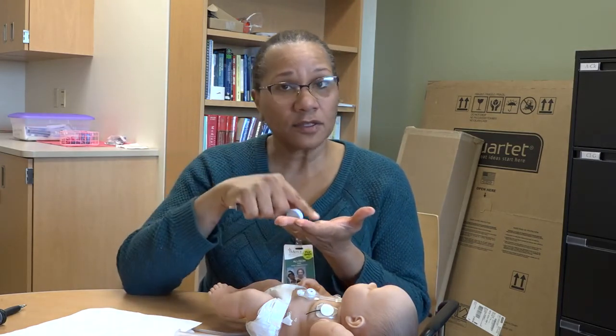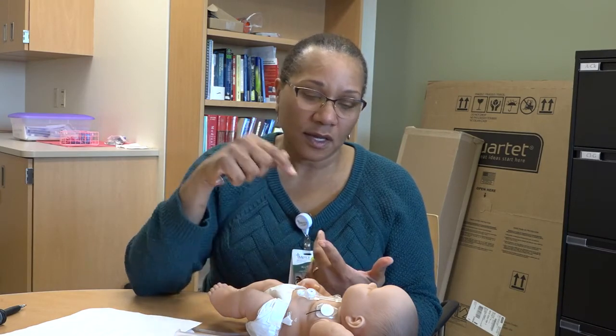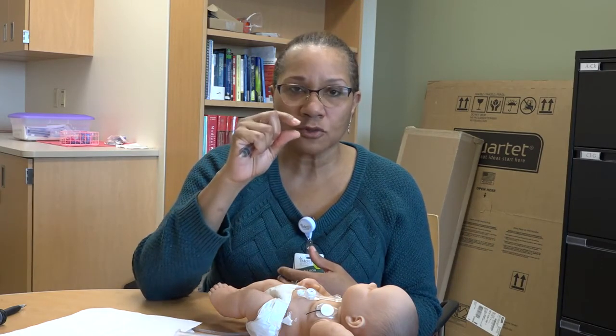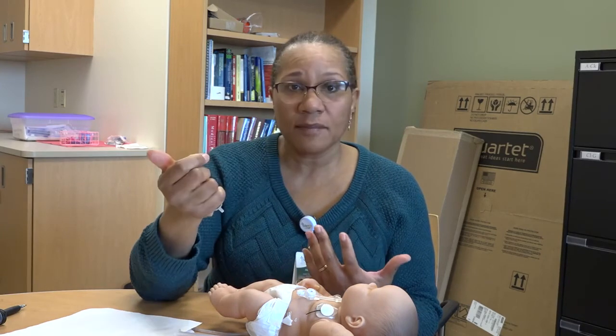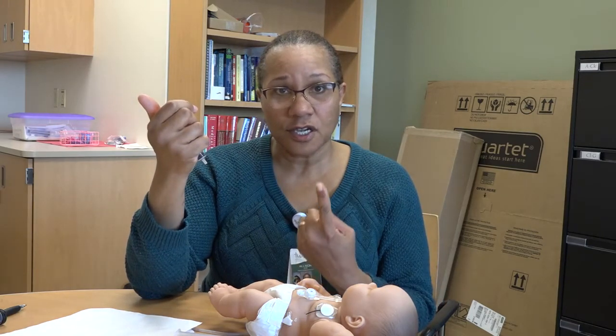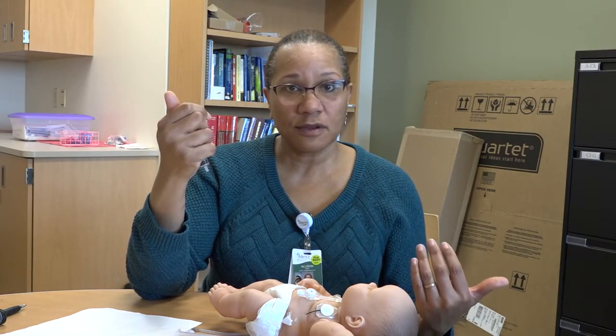So the other thing about medications is, let's say it's a medication that can't be made liquid. It has to be a pill. Then the pill would have to be crushed. You add a little bit of water and you mix it in solution. You want it totally dissolved. Then you can administer the medication that way also. Any medications that can't be crushed, any medications that have little capsules or little balls inside, those can't be given through the G-tube either. So, making sure that it's medication that can go through the G-tube, liquid, or pills that can be crushed, and making sure that you're flushing afterwards, because those medications can be syrupy, they can build up on that anti-reflux valve. So making sure you're flushing after that.